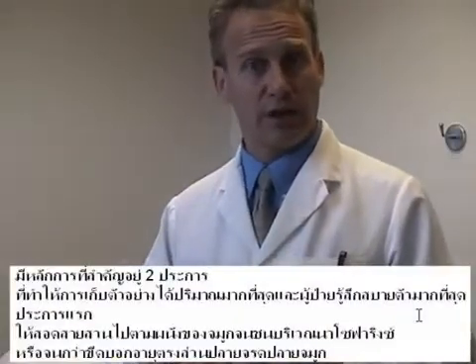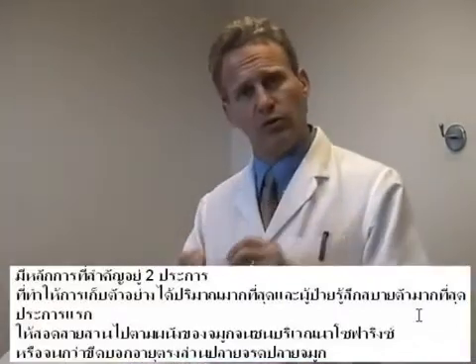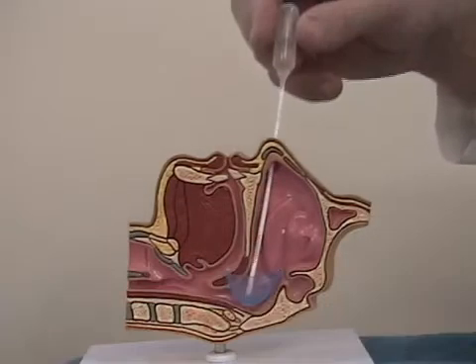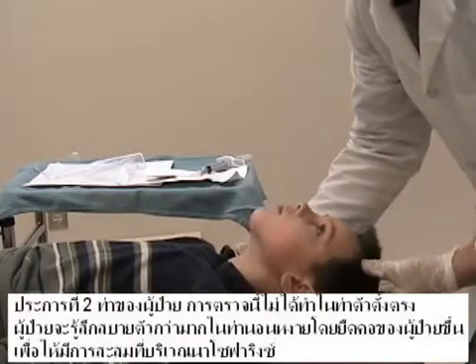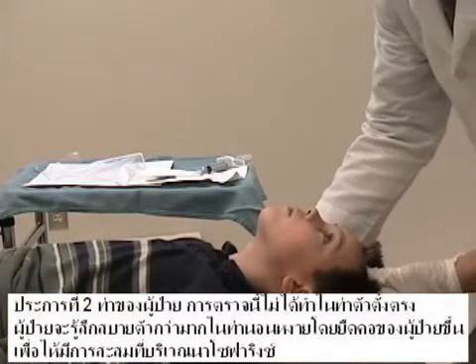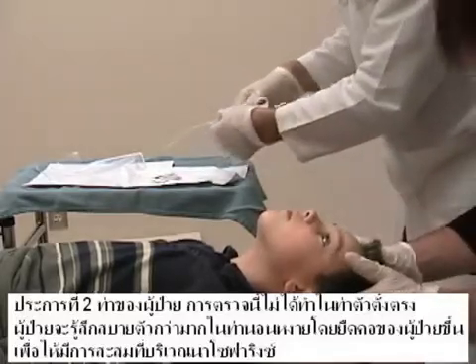There are two key points that are important to maximize the specimen collection and the patient comfort. Number one, following the floor of the nose with a catheter until resistance is met in the nasopharynx where the age calibration mark is met in the front of the nose. Number two, patient position. This is not an upright procedure. Patients are much more comfortable in a supine position with their neck extended to allow pooling in the area of the nasopharynx.